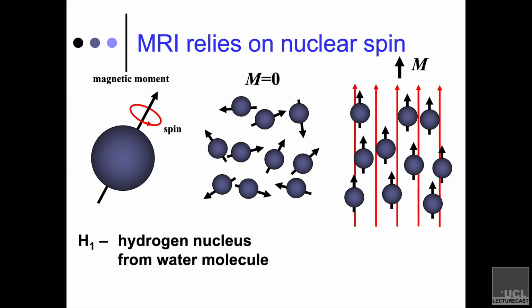In this particular image, you can see that the magnetic field is going from floor to ceiling, and when you put the hydrogen nuclei within that field, on average they tend to line up that way. Now this is an oversimplification because you can see that all of them are lined up with the field in this image. That's not strictly true, but it acts that way. And at that point, once you're in the magnetic field, you do have a net magnetic property.